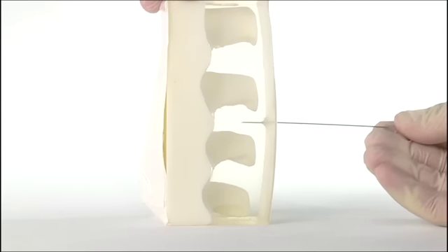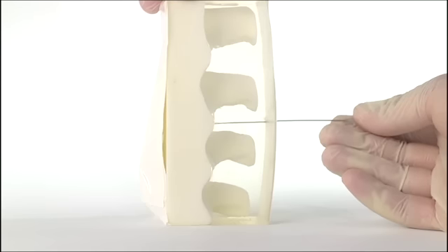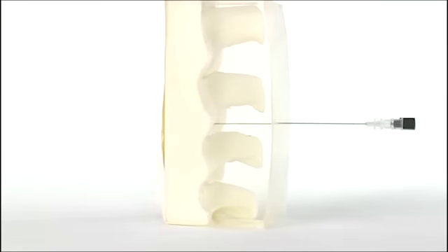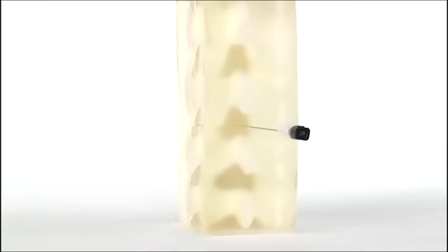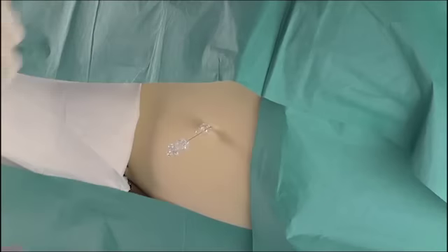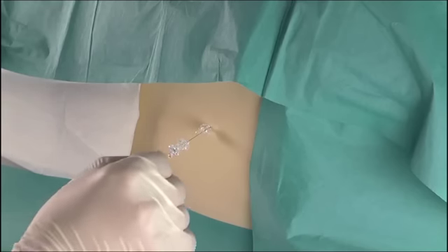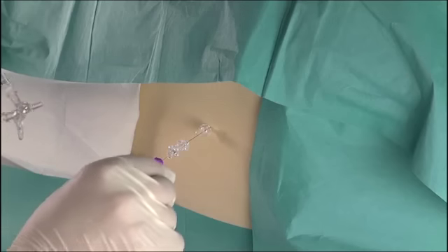Insert this needle a few millimeters at a time, and at each point remove the stylet to assess for cerebrospinal flow. Once you have established that there is a cerebrospinal fluid flow through the needle, remove the stylet. This can be replaced for the short term to reduce the flow.